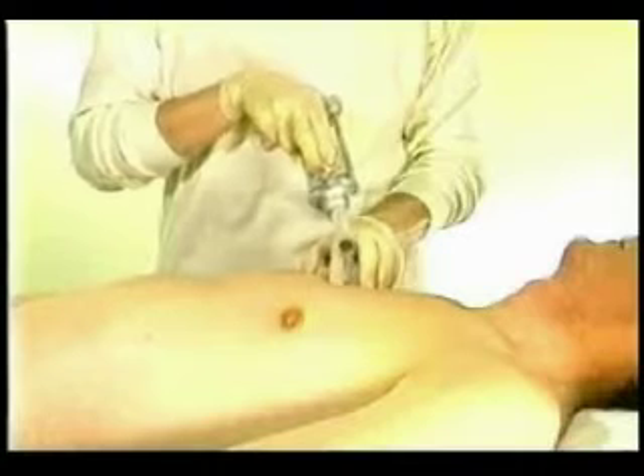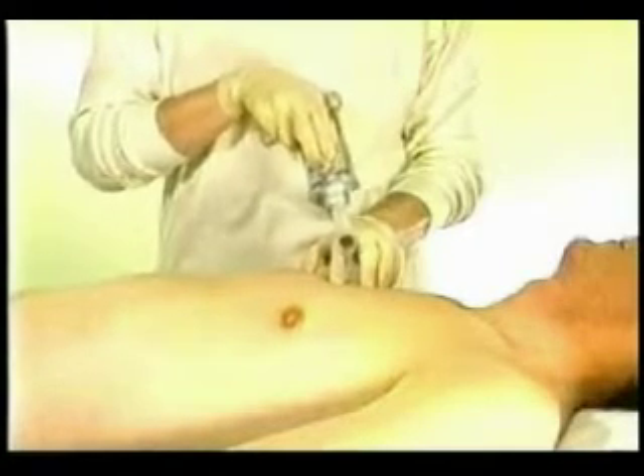I'm now in a good position to go ahead with the sampling and will move right along. This sample consisted of a small, semi-solid droplet that lent itself very well to division and the basic smearing technique. One slide was fixed in 95% ethyl alcohol and the other one was left on the table to air dry.